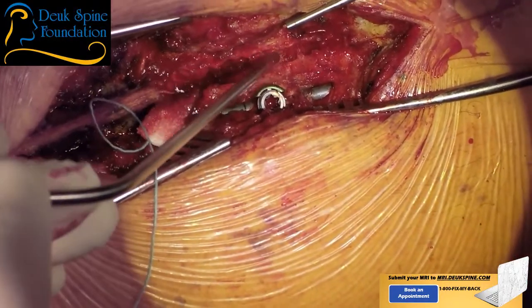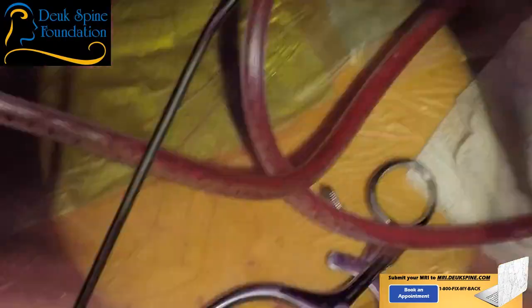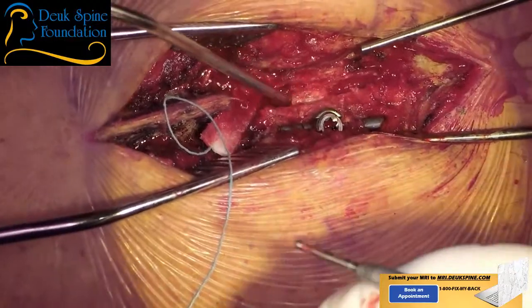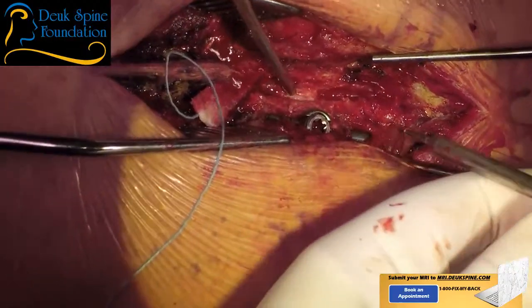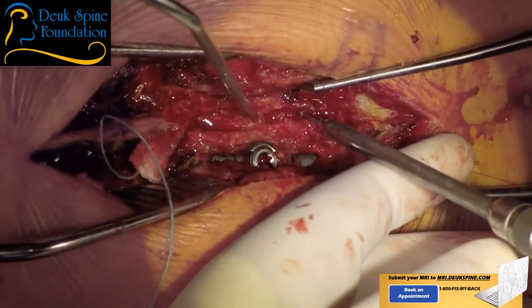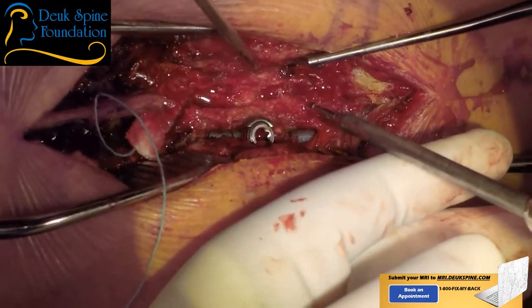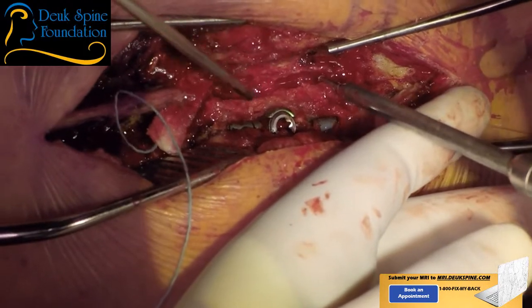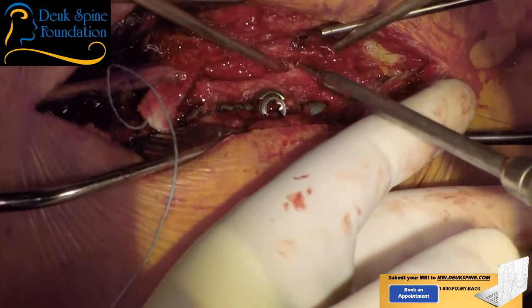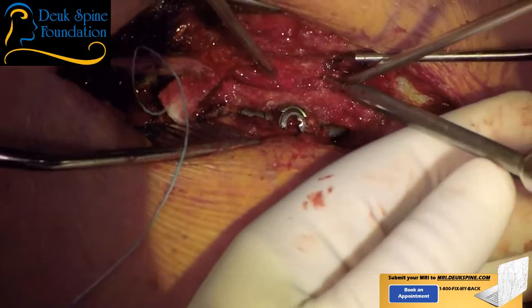I'm going to try to drill that. We have another question. Sure, drill. We have a Facebook viewer wondering, can you get rid of arthritis while you're in there? I didn't hear what they said. You need one sucker here. Forget about the bone. You need one sucker here so the blood doesn't drain down to here. One sucker here and one sucker sweeping up top, right here.